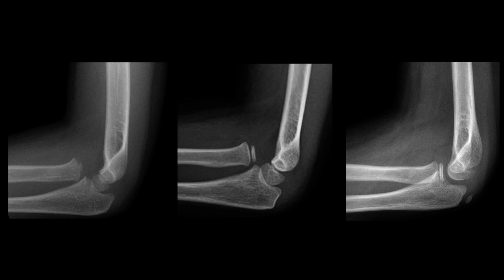Here are three cases of children who have presented to the emergency department with elbow pain after a fall. Take a look at them and work out if there is a radial head dislocation. If you're not already viewing this in high definition, give it a try.